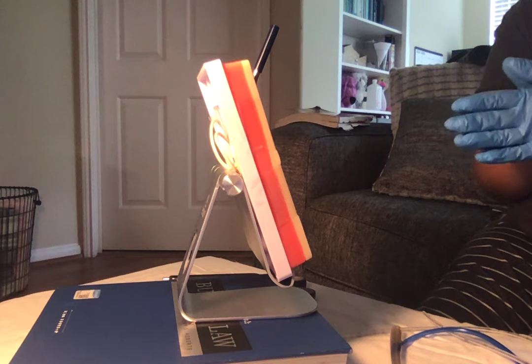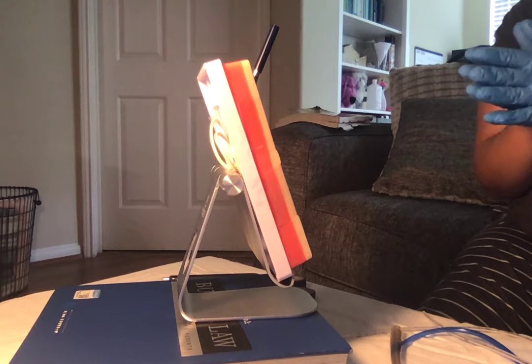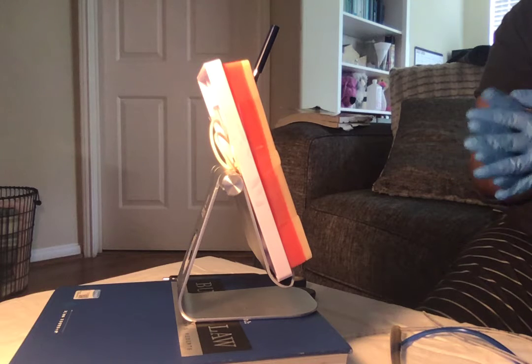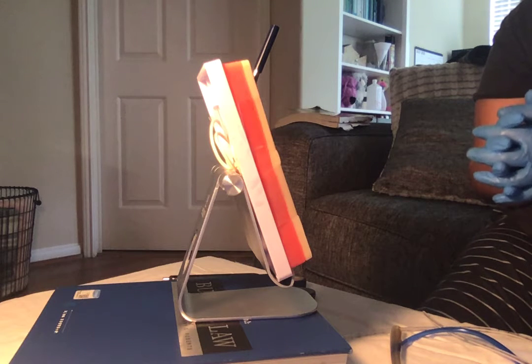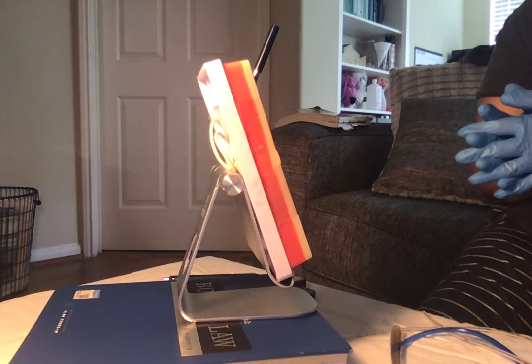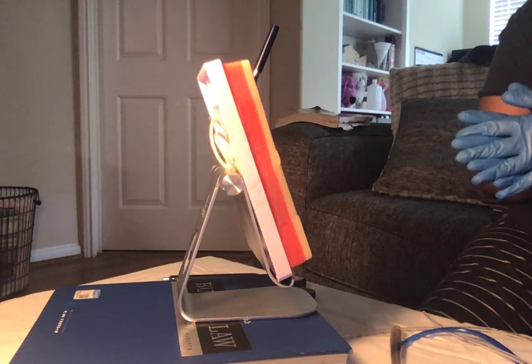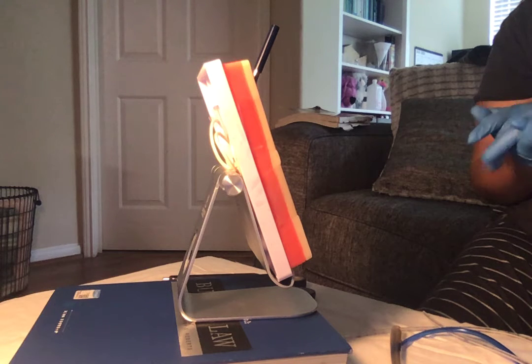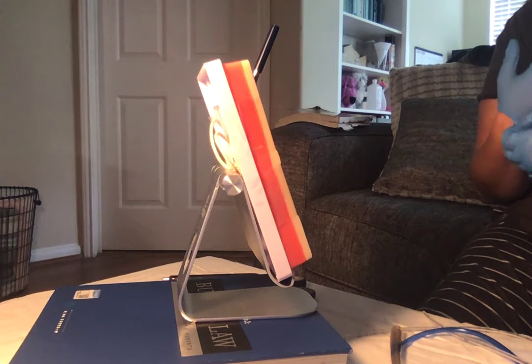I'm going to assess the client's level of consciousness, their ability to cooperate, and their ability to move in the correct position for placement. I'm going to assess the client's nares and oral cavity, look for a deviated septum, nasal surgery, inability to breathe well, and if the nasal opening is occluded or irritation with bleeding. I'm going to reassess their ability to cooperate.